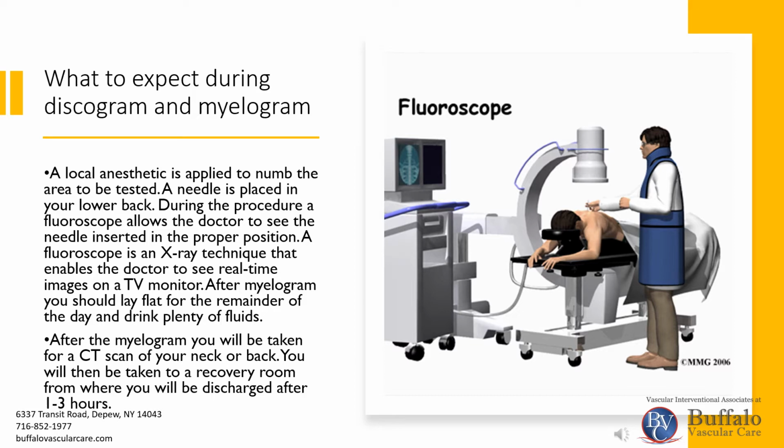During the procedure, a fluoroscope allows the doctor to see the needle inserted into the proper position. A fluoroscope is an X-ray technique that enables the doctor to see real-time images on a TV monitor. After myelogram, you should lay flat for the remainder of the day and drink plenty of fluids. After the myelogram, you will be taken for a CT scan of your neck or back. You will then be taken to recovery room where you will be discharged after 1 to 3 hours.